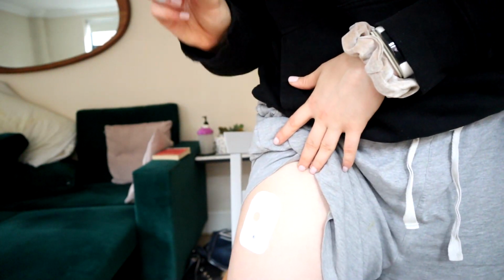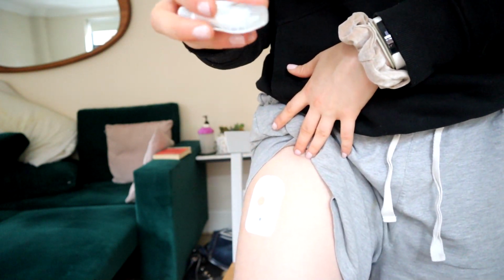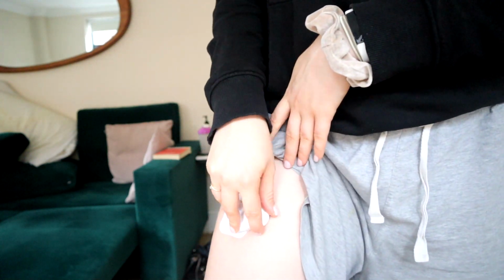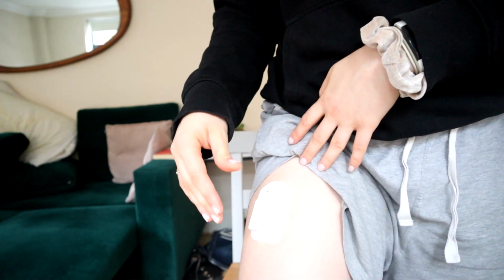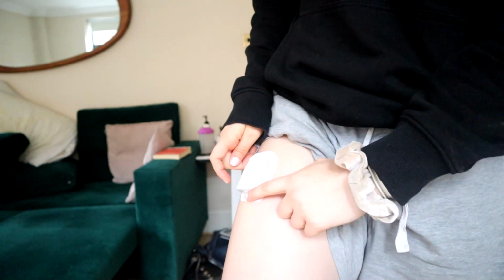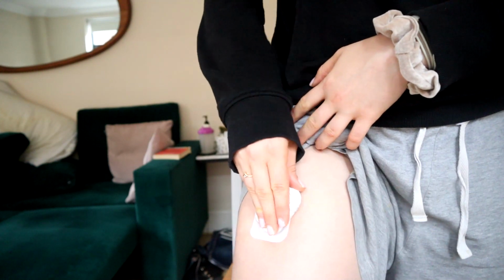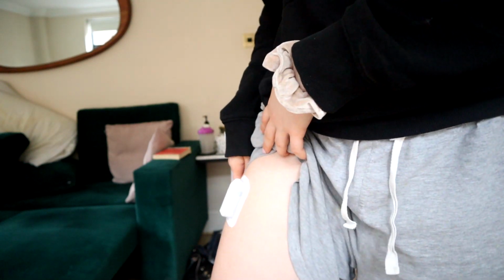Okay, so to attach the pump, it's a bit of a twist and click motion. So you can see here, that is where the cannula is obviously going into my leg, and here is where the insulin is coming out of the pump. So you have to line that up, sideways on, and then push down as you twist, and you have to hear 2 clicks. I don't know if you heard that, so I'll just do it again so you can hear what it sounds like. And then, like I said, you can connect and disconnect it. You just put your finger on the small white tab here, and pull it off. So let's try doing those 2 clicks again. Hopefully you heard that. And then this is the pump on my body.